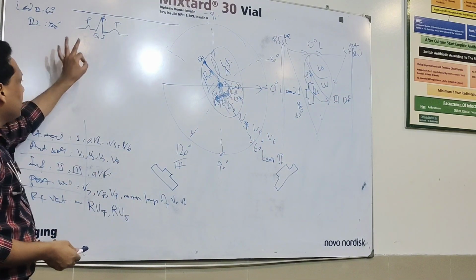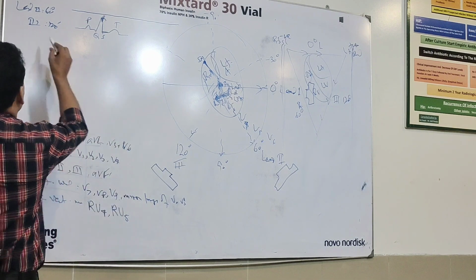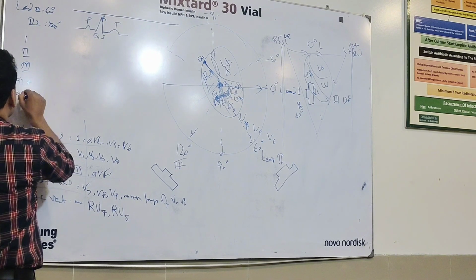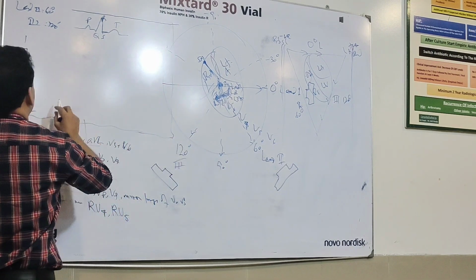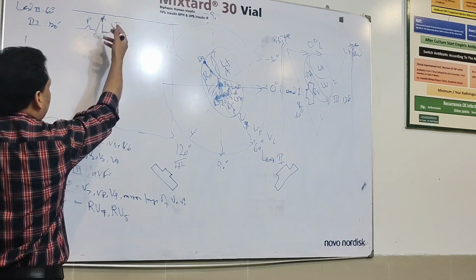Now I am drawing these 12 leads. Why do they look different? So lead 1, lead 2, lead 3. First I draw these 6 limb leads, and onwards it will be so easy that you can comfortably draw the rest of the chest leads as well. This is the normal ECG which you would be seeing in a normal person.